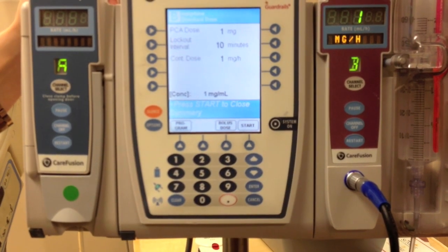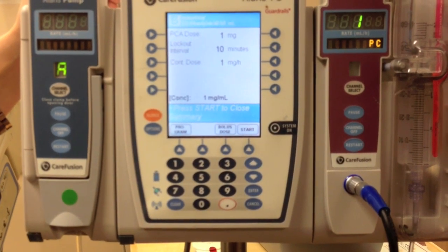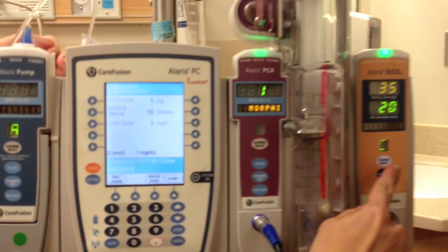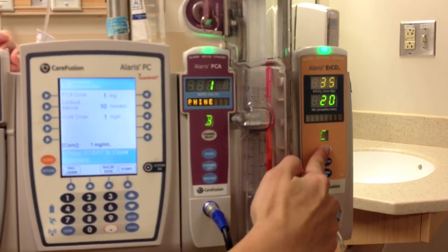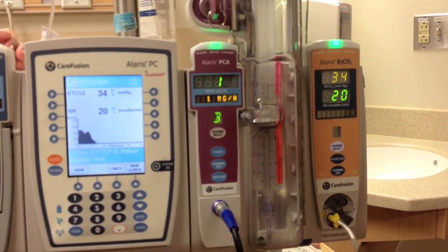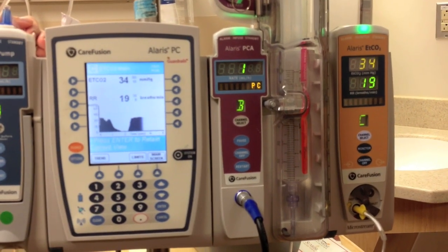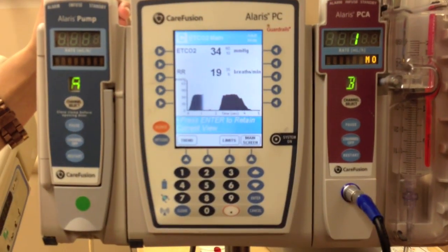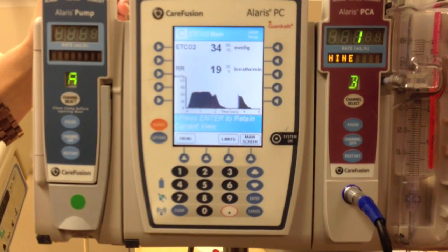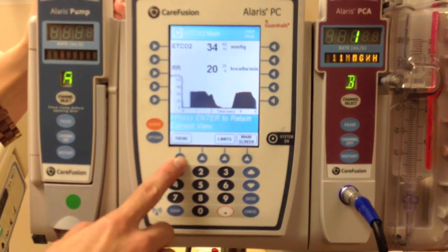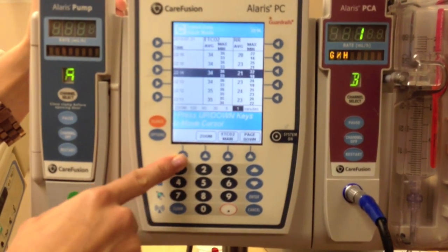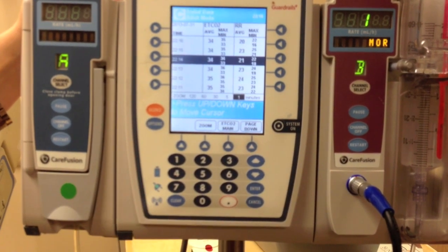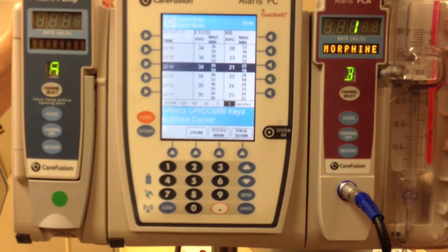Review the end tidal CO2 by channel selecting on the end tidal CO2 compartment. Verify the end tidal CO2 on the screen. To look at the trend, press the trend button on the bottom of the screen. Review with the nurse to make sure that the values are verified.